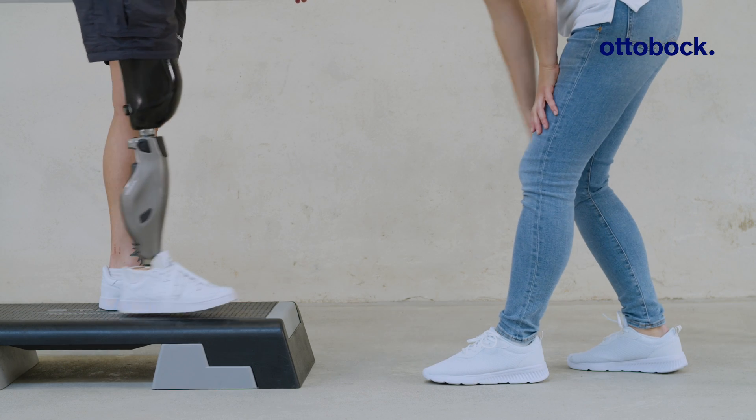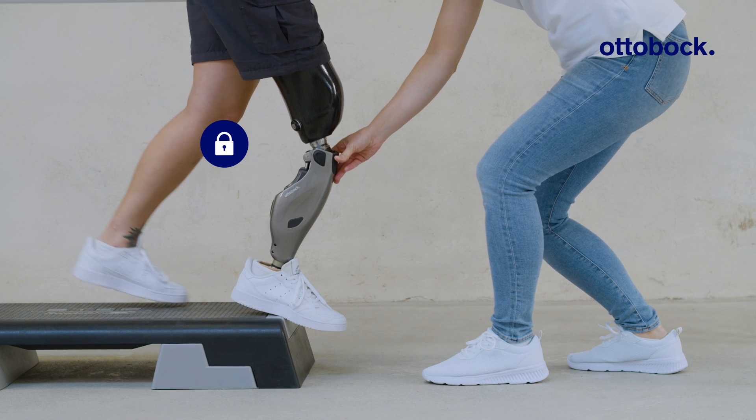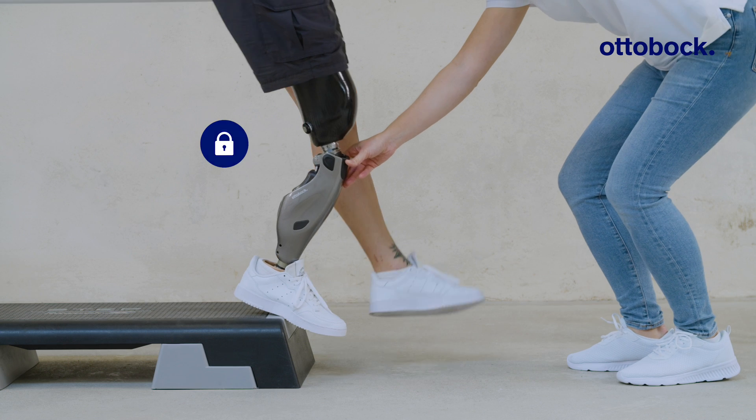As an advanced exercise, users can lift the contralateral leg while the stance function is active. This helps to build trust in the prosthesis.